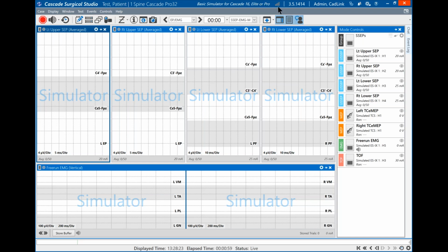The 4 bars here, if someone were connected to you remotely, this would tell you the connectivity of the live reviewers, the version of software we're running, the user that's logged in running the procedure, the direct connect information, and of course, switching users, CAD capture, and a question mark. Below that is what we call the menu bar. And of course, you've got this on Classic. So any of these, if you click on them, you will get a menu of things that can be done.